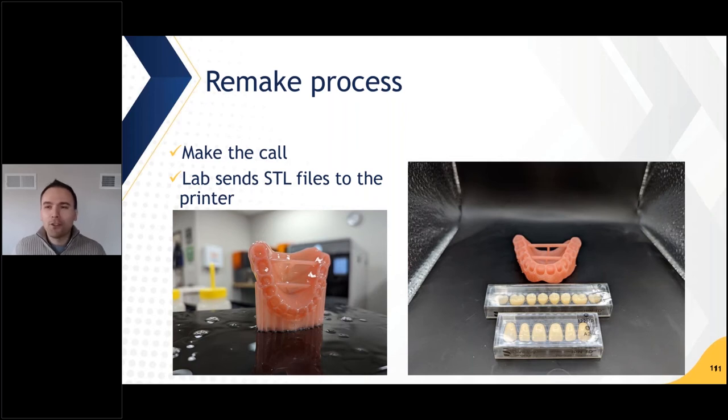My idea was, if I was a dentist, which I'm not, every time I would sell a denture to a patient, I would give them a very inexpensive USB flash drive with an STL file of the denture base, and I would give them one set of carded teeth as a backup, put it in a box, and either save it myself or have the patient save it. If they ever, throughout life, in 10, 15, 20 years, travel somewhere, go to another country, city, or town, they can go to whichever dentist or lab they want, give them those files, and the denture will be reproduced exactly the way it was before. That's the kind of redundancy that's just making everyone's life easier.